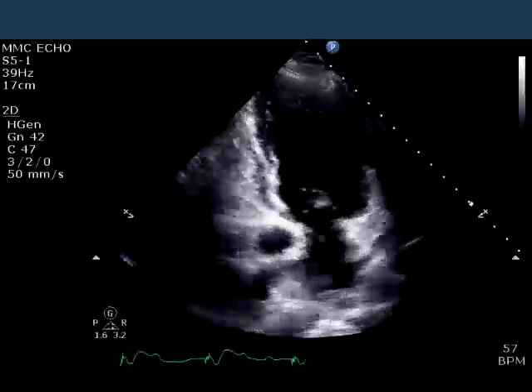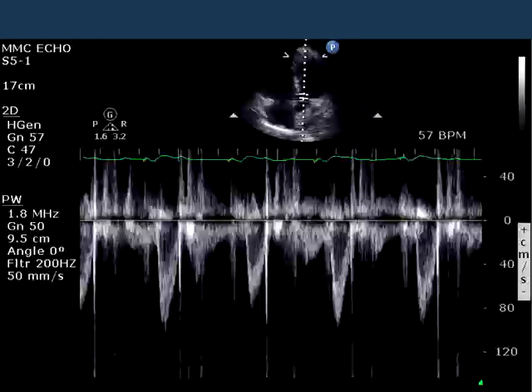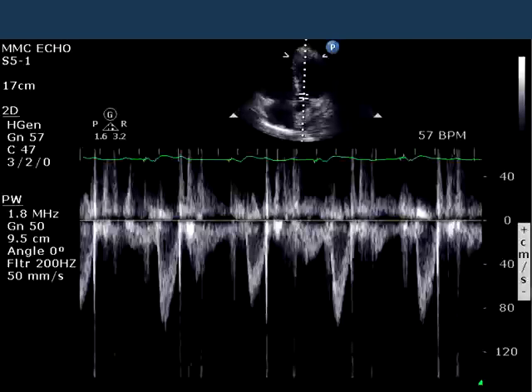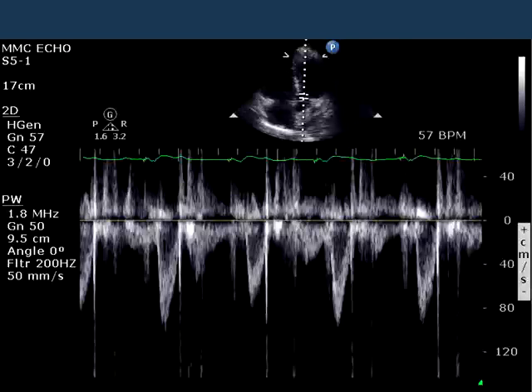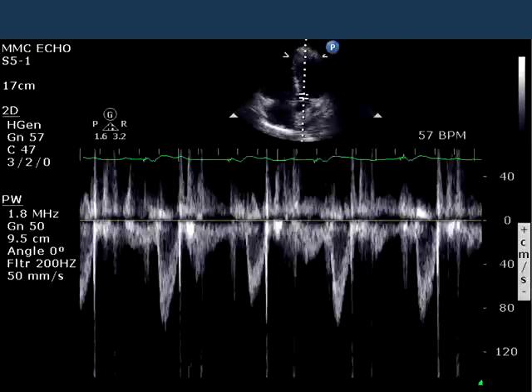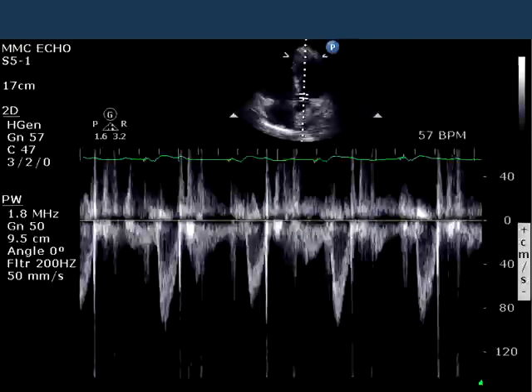In the next slide, you can see pulse-wave Doppler with the sample volume placed in the left ventricular outflow tract in the five-chamber view. Despite the fact that the R-R intervals are regular, the envelopes are varying in size — some as low as 80 centimeters per second, some down to about 100 centimeters per second.